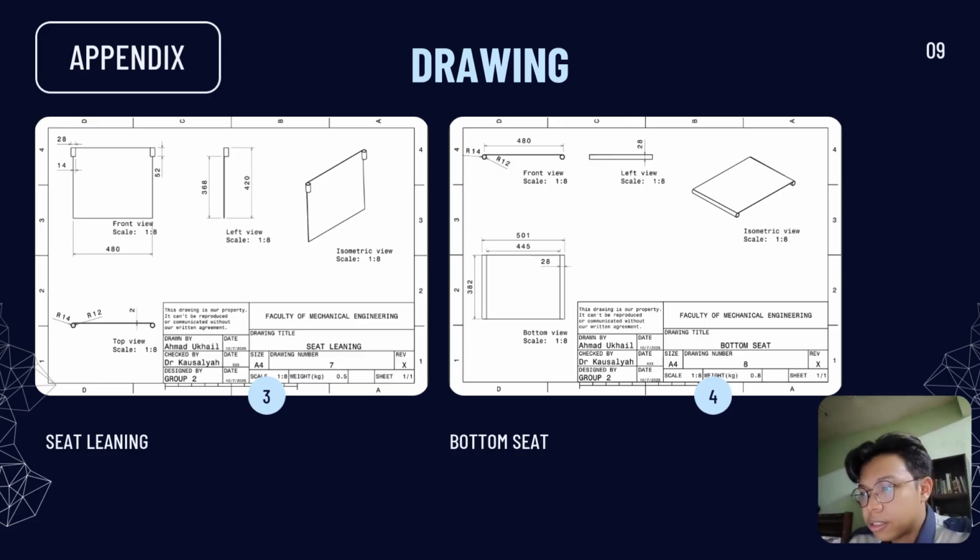Moving on to the next part drawing, which is the seating part of the wheelchair, where we have the seat leaning for the back support of the user, and also the bottom seat where you actually sit. The design is not intricate, pretty simple and straightforward. All of it is just for the sitting area, and in our assembly it's pretty ergonomic, so quite comfortable for the user of the wheelchair.